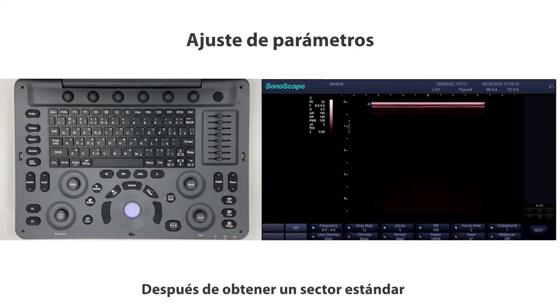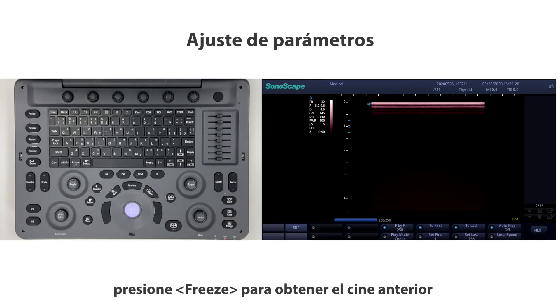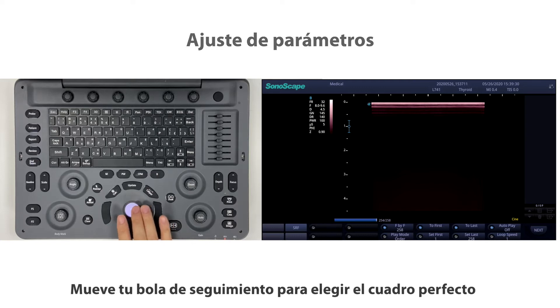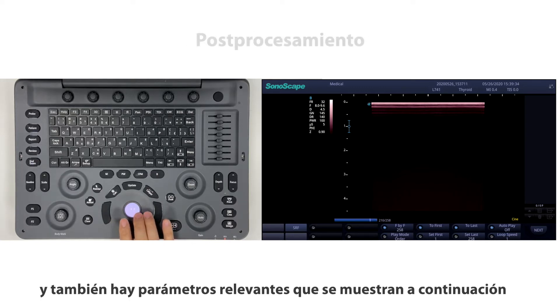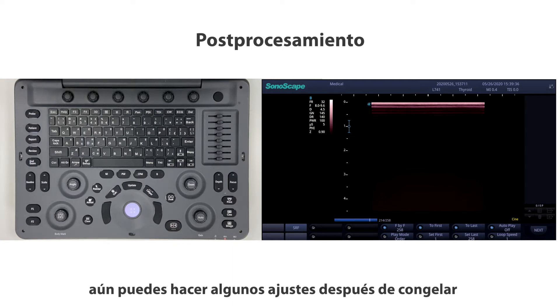After you get a standard sector with good parameters to fit your need, press Freeze to capture the cine. Move the trackball to choose your perfect frame — relevant parameters are also displayed below. You can still make some adjustments after freezing.